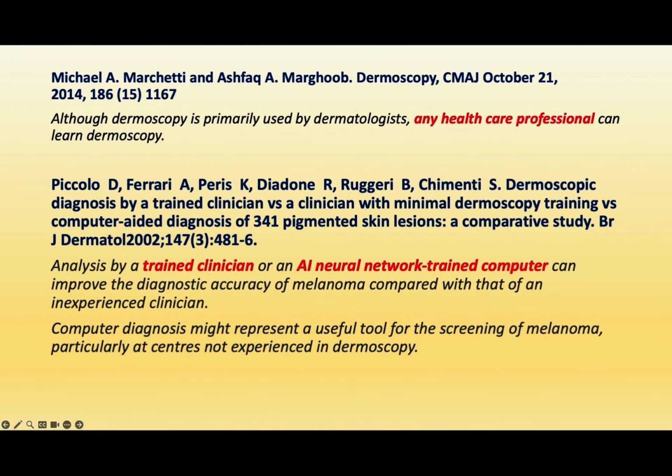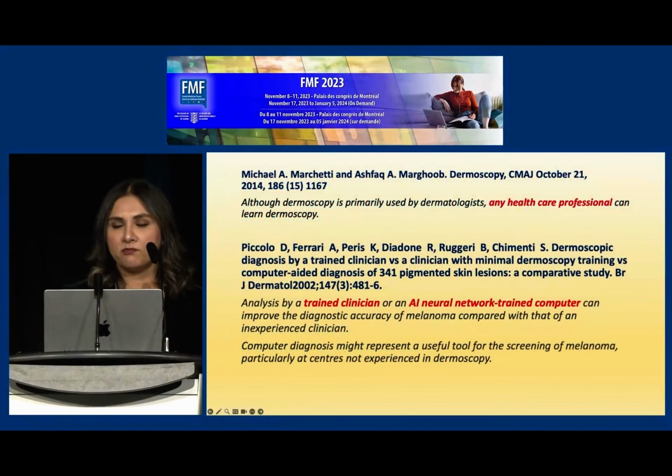Margoob and Marchetti said that although dermoscopy is primarily used by dermatologists, any healthcare professional can learn dermoscopy. I have nurse practitioners, nurses, medical students using it in our clinics. The literature also says that analysis by a trained clinician or an AI network can improve the diagnostic accuracy of melanoma. So that's another argument to say, why use dermoscopy when we have AI networks? I can just take a picture, plot it, and then it'll give me the answer.